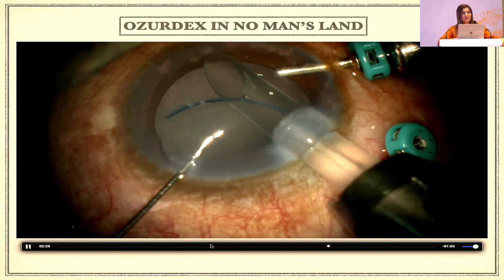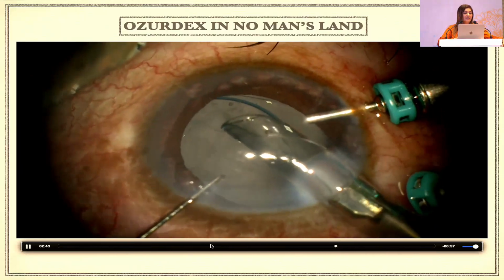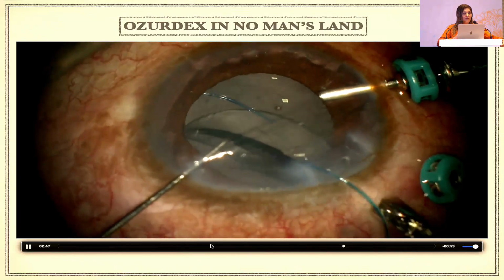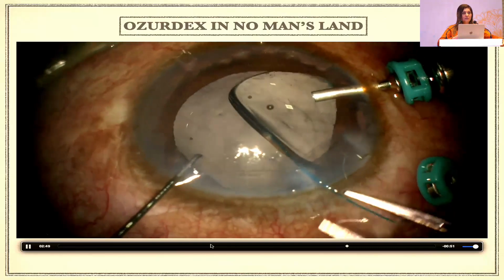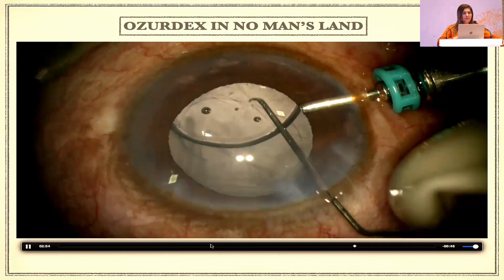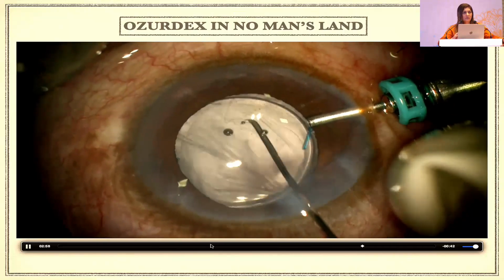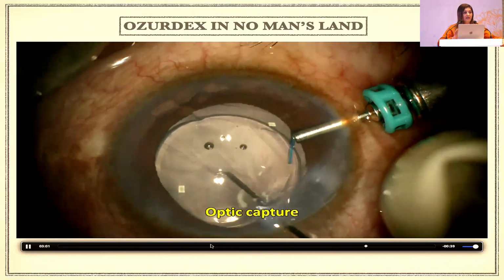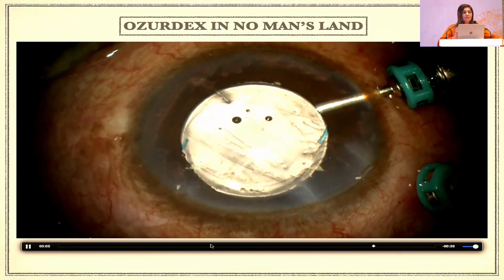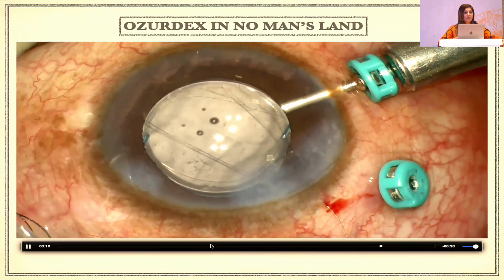Anyway, I would always recommend, whenever you are taking up any challenging case, have a 3-piece intraocular lens standby, because you actually do not know when you would need it. And what happens is that I have seen surgeons who do not have a 3-piece IOL standby. So you are forced mentally that, okay, I have to put the lens somehow, what will I go and tell the relatives? Nothing of that kind, because that becomes a very tricky situation. So I think it is best to have a stock of 3-piece intraocular lenses, a few lenses in your armamentarium.